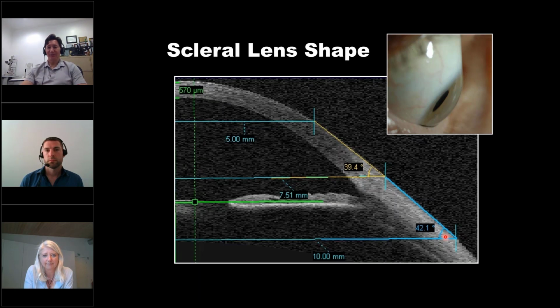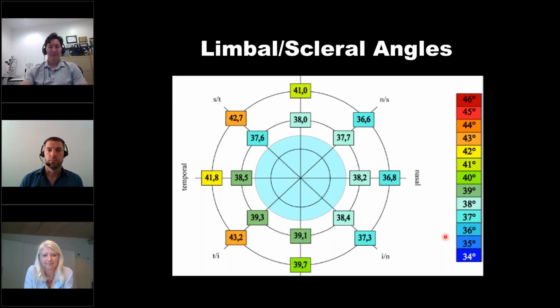And I'm sure everybody has seen this slide that my colleague Pat Caroline put together. Now, what was interesting from this work was if you look at the angle differential at around a 10 millimeter chord, a 15 millimeter chord into 10 millimeters, the eye has approximately 1.7 degrees of differential all the way around the clock.